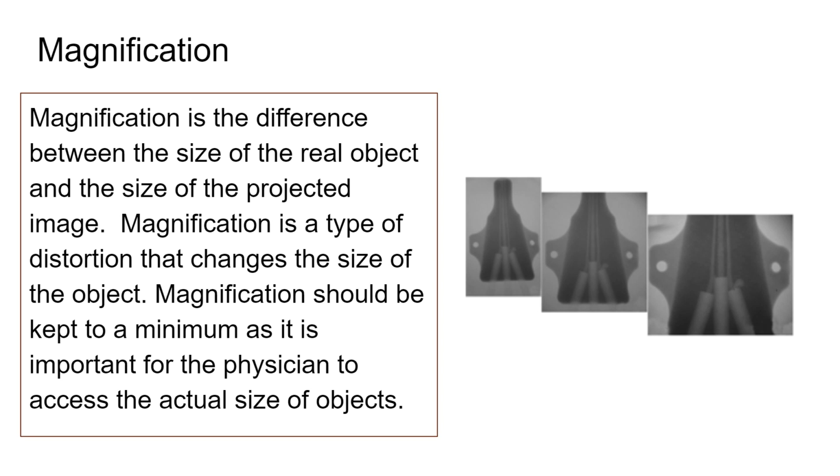Sometimes magnifying something is helpful, just to see something that you might not have seen before. I know it sounds counterintuitive, but the sharpness increases when magnification decreases. So we don't really like magnification most of the time.